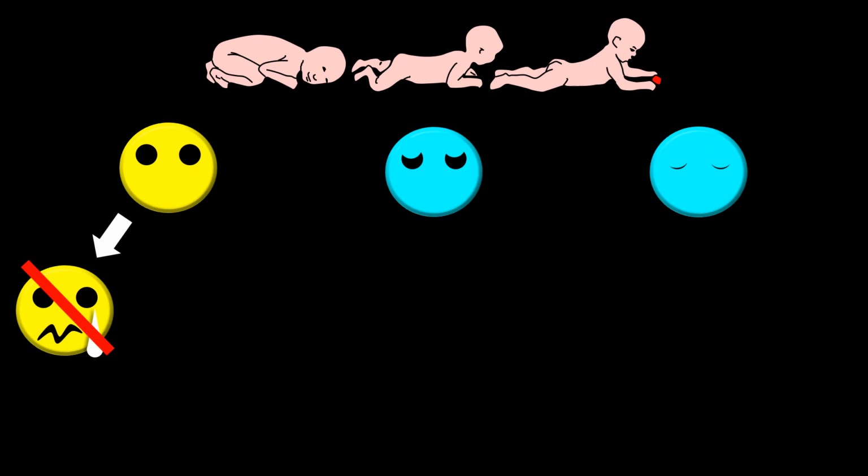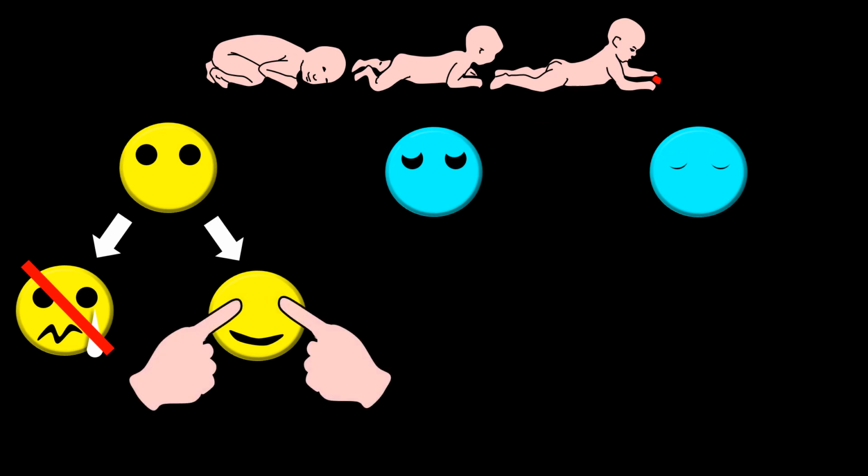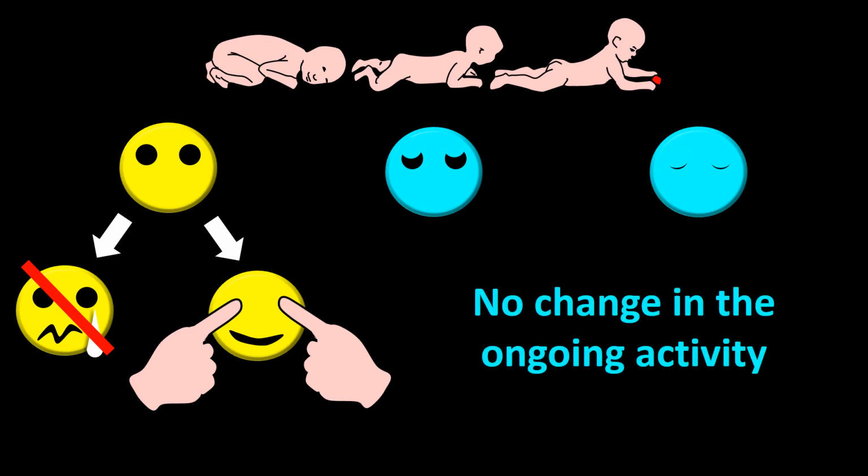Most of the awake period, because of the discomfort of the electrode placement, will produce an unreadable tracing. Brief periods of quiet awake are sometimes present, and the technician should take advantage of them. This advantage should be to close the infant's eyes during those periods of quiet wakefulness. During the first 3 months of age, closing the eyes of an awake infant does not trigger a change in EEG activity.